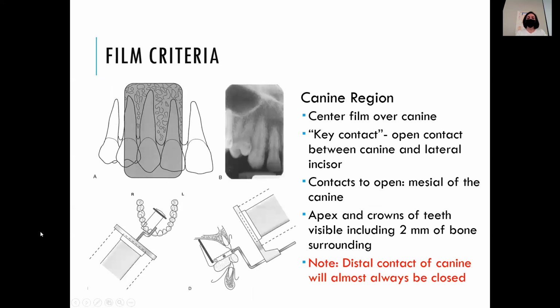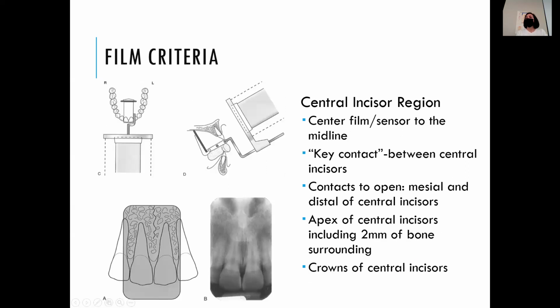Oh, wait, hold on. And then here you can see about where they placed it. Here's your BID up against, and here's the sensor. And then it's showing how the sensor is pretty parallel to the teeth. Here's a side view. The sensor is parallel to the incisors, and the incisors are biting on the top and the bottom of the bite block.